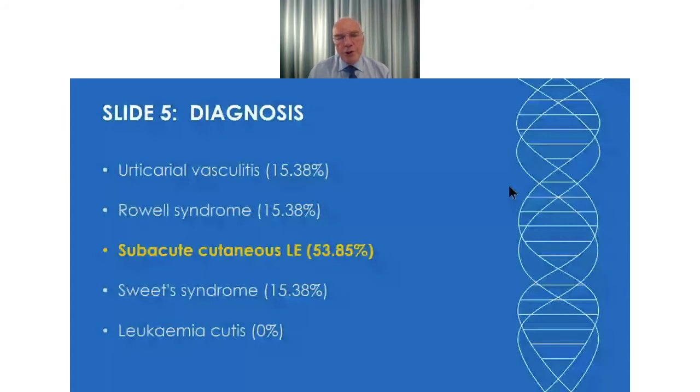Immunofluorescence will show you the speckled band of immune complexes deposited in the basal membrane zone, and I think that's what we could see here. I think the PAS staining and that eosinophilic layer beneath the epidermis is where the immunofluorescence will be positive. I don't have immunofluorescence on this case.